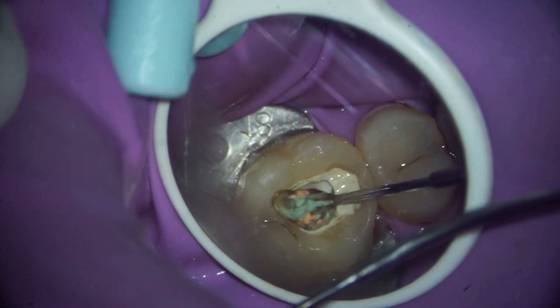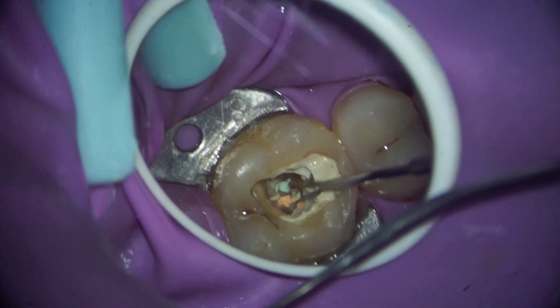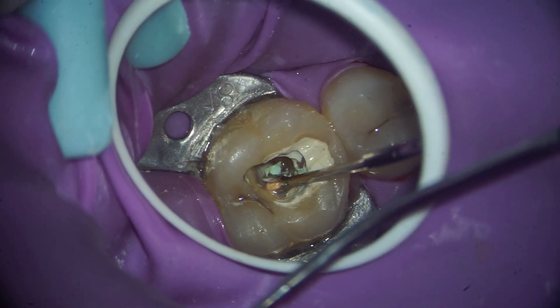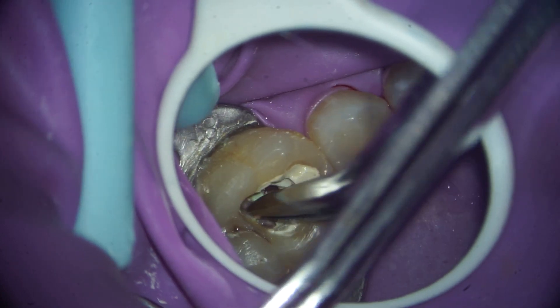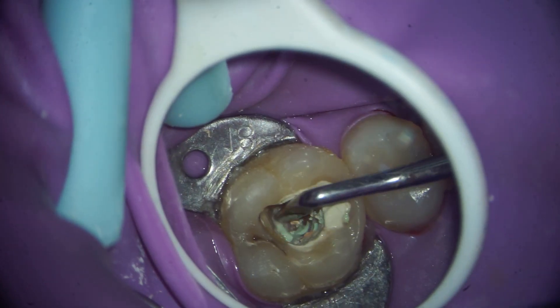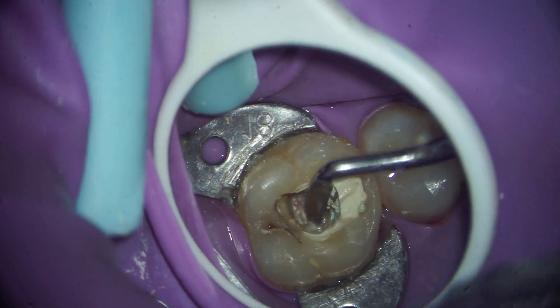Let's remove these gutta-percha cones. This is a micro tweezer — luckily the root canal is positioned such that I can easily pull out all these gutta-percha points. This is a micro tweezer by Micromega. Since it was slipping, I'm also trying to remove these gutta-percha cones with a normal tweezer. This is the disto-buccal gutta-percha point.